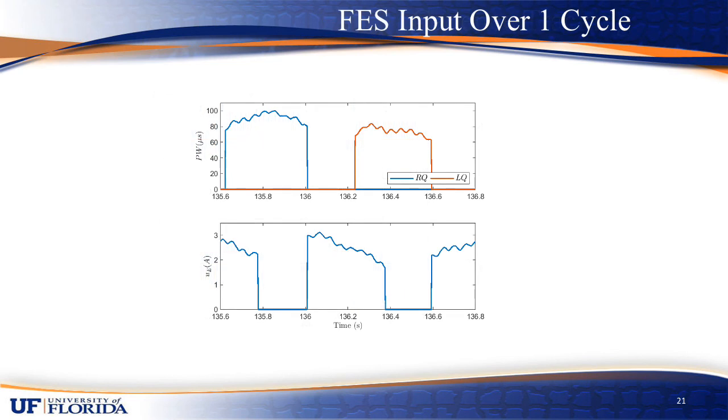The FES and motor inputs over a single cycle are shown in this figure to demonstrate how both the motor and FES inputs switched on and off throughout the crank cycle.